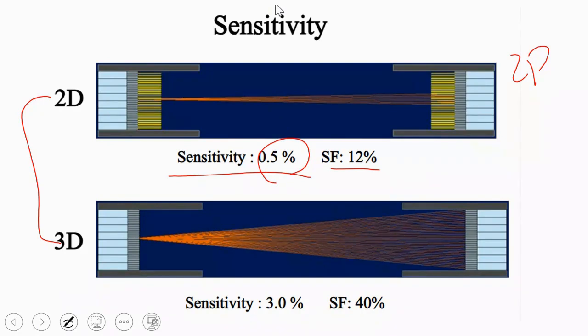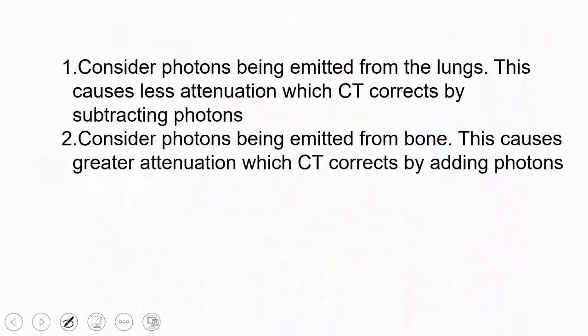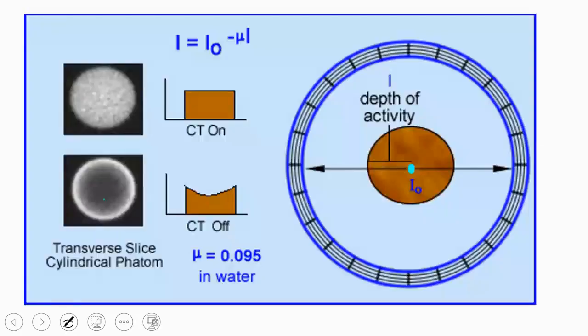The sensitivity decreased due to the presence of the collimator. In 3D mode, sensitivity started to receive from more than one angle without any issues because there is no collimator, but it increased the scatter fraction to 40%. Okay, so guys, why is the calibration process, including resolution and sensitivity, so important for our understanding and decision making?